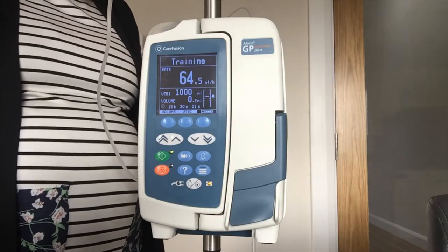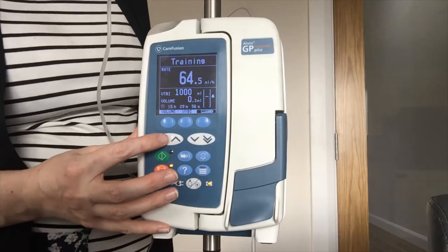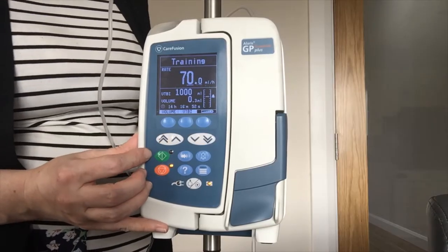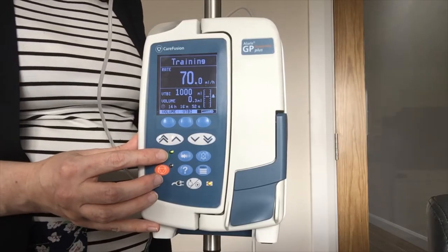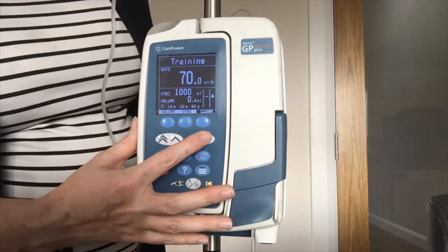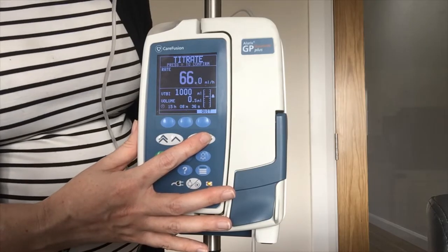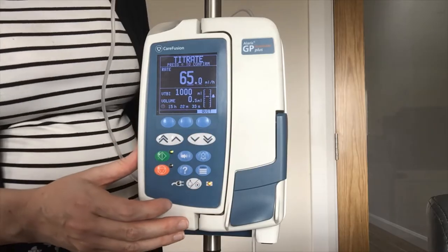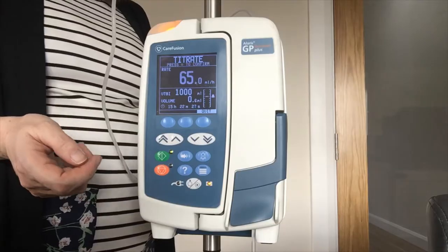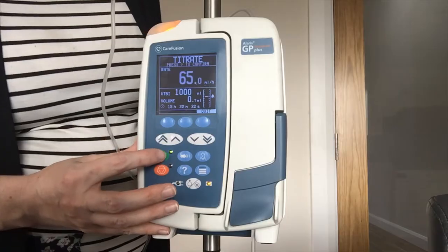If I need to change the rate I have two options. I can either put my pump on hold with my orange key and then adjust it using my arrows up and down — so that is my new rate at 70 — and then press green again to confirm it. The other way is titrating without putting it on hold: you adjust using your arrows and the pump keeps infusing at the old rate until you confirm the new one. For example I bring it back down to 65 — it is still infusing at 70 until I confirm the new rate with the green key. If I forget to confirm, I have a little indicator reminding me to come back and confirm the new rate.